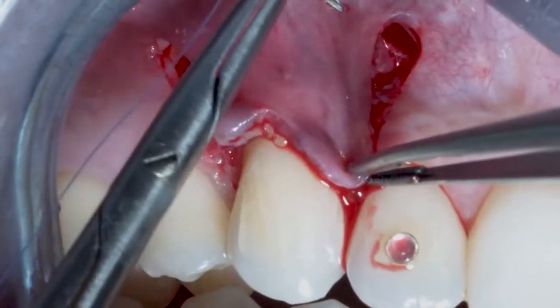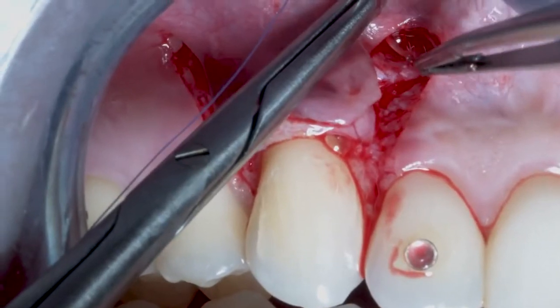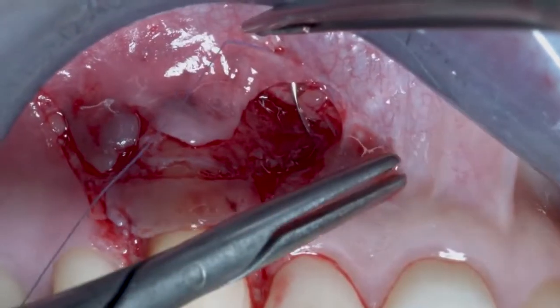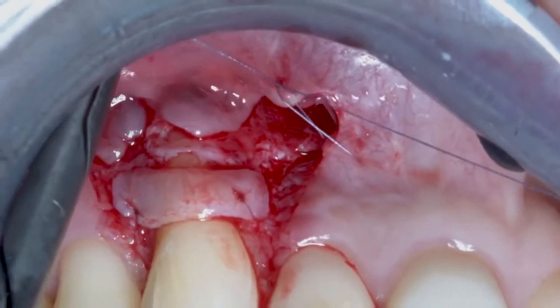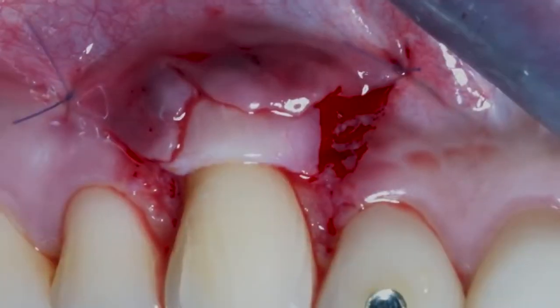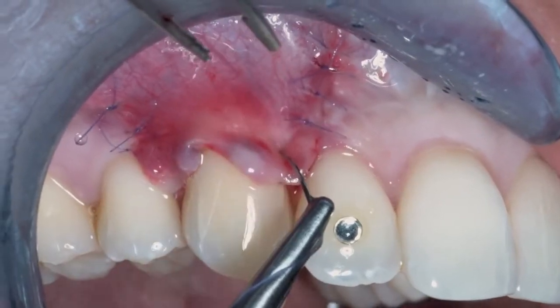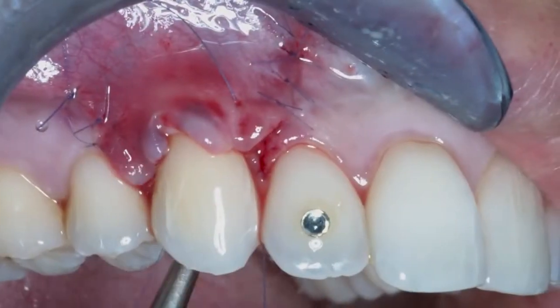The fourth concept is to start the sutures from the apical portion of the vertical incisions. You need to give the last suture — the sling suture — without any tension. You are used to giving the sling suture in keratinized tissue, but in these cases you are giving it in alveolar mucosa, so the tissue is very weak and tension could perforate the flap. Eliminate all tension by starting from the apical part of the vertical incision.